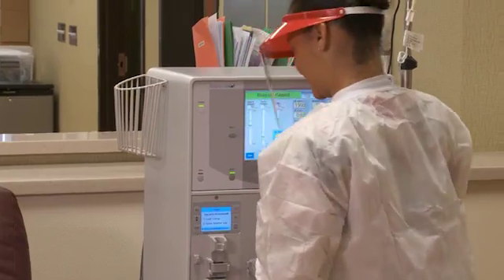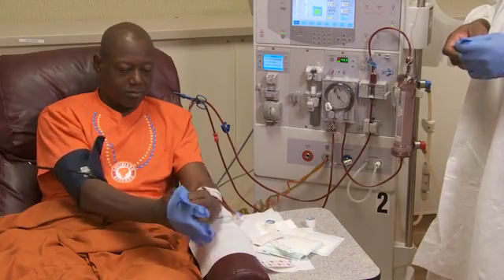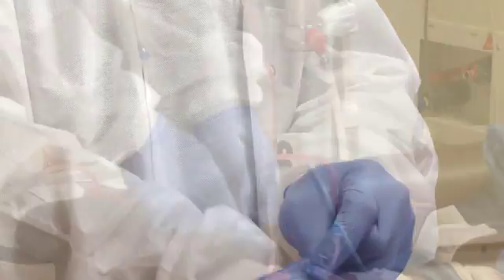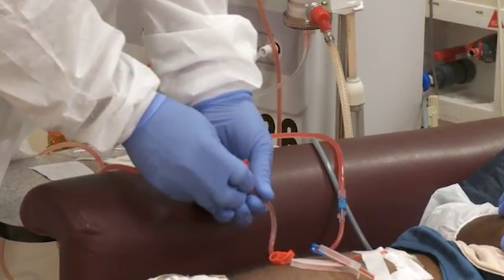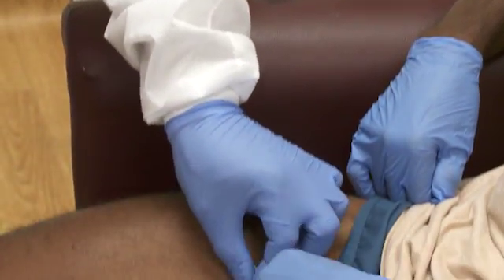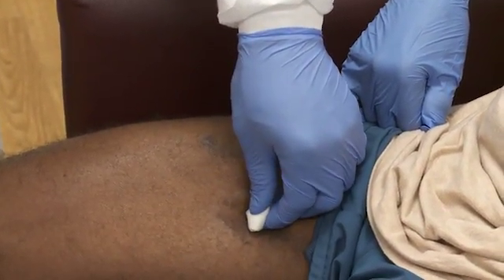When the patient has completed treatment, here are the steps for fistula or graft decannulation. Put on a gown and a face shield. Assist the patient with gloving if they will be compressing their access site. Perform hand hygiene and put on a new clean pair of gloves. Disconnect from the bloodlines using aseptic technique. Activate the needle retraction device and remove needles using aseptic technique. Dispose of the needles in a proper sharps container. Apply clean gauze or a bandage to the access site and compress it with clean gloved hands. Both the staff and patient should remove gloves and perform hand hygiene. Following these steps will reduce the risk of an access-related infection.